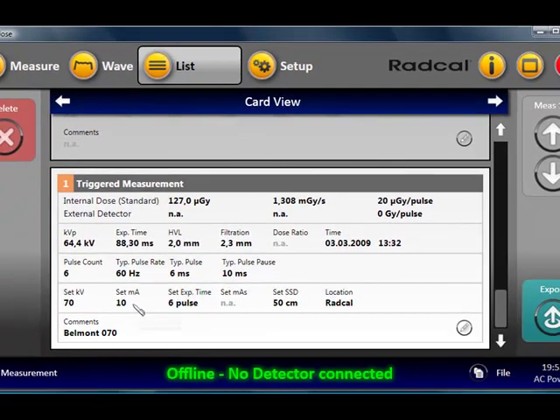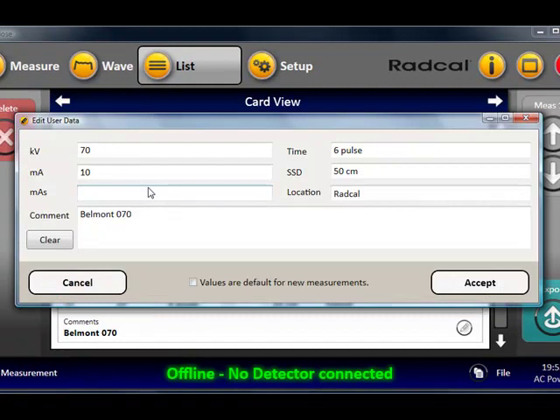Here I had previously entered information about my measurement setup. And now let me tell you a little trick. When you collect data with the USB multimeter, enter the user information after completing the first measurement. If you check this option, the information you entered for this measurement will be copied subsequently to the others. This is just a small feature to have good documentation of your generator settings, tube settings, and overall setup.